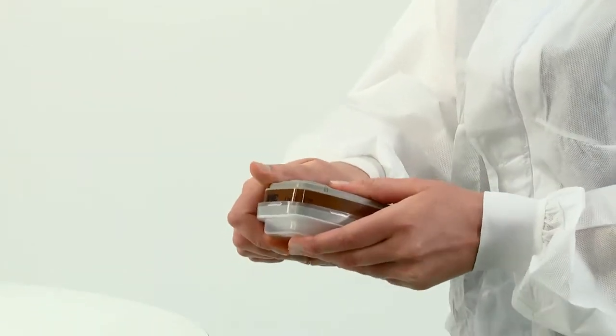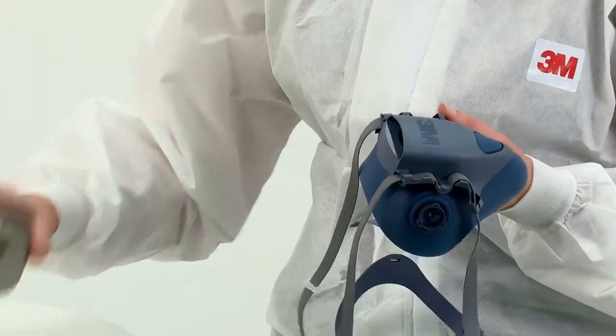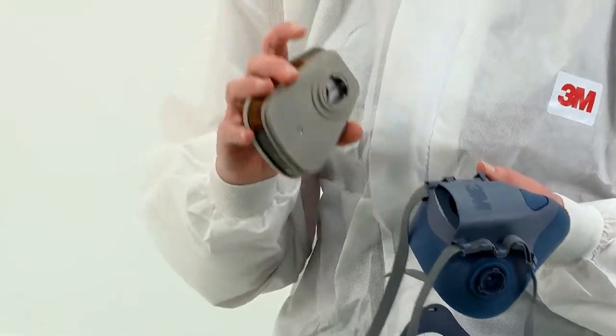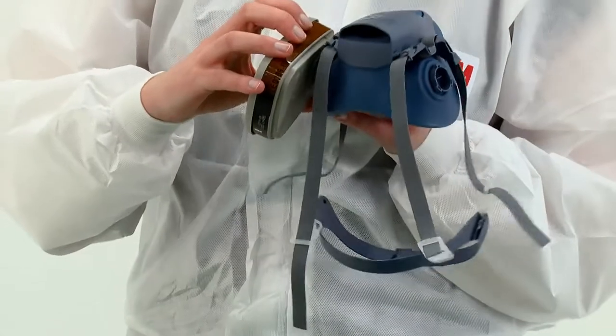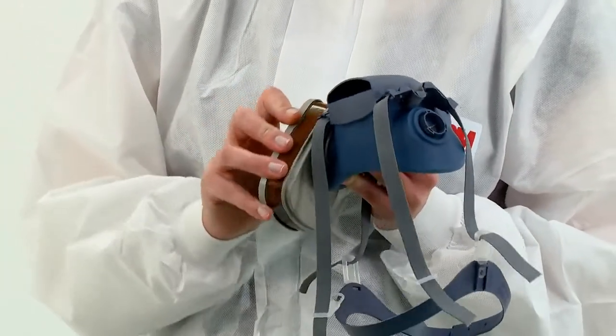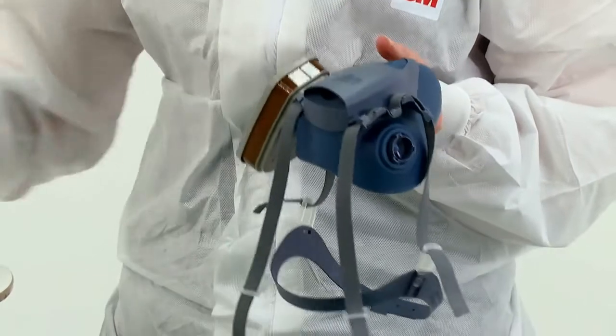To fit gas and vapour filters or combination filters, align the lines on the inside of the filter to the arrow on the mask and secure in place with a quarter turn clockwise. Remember to always replace filters as a pair.